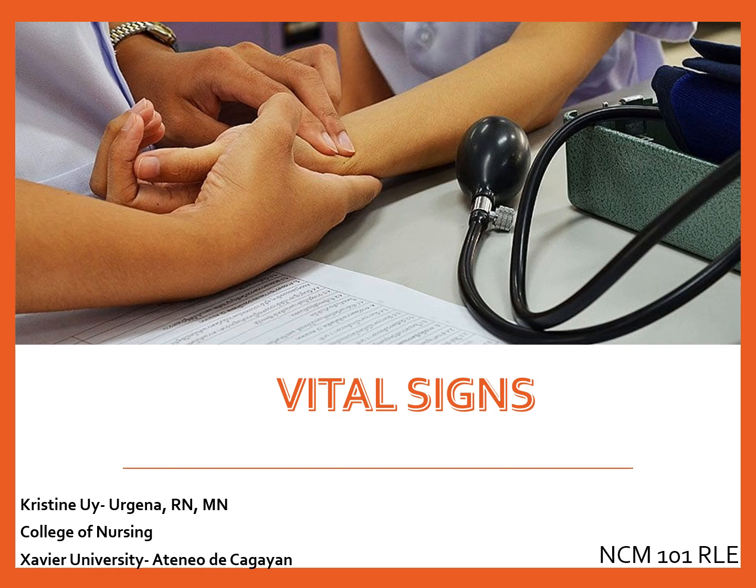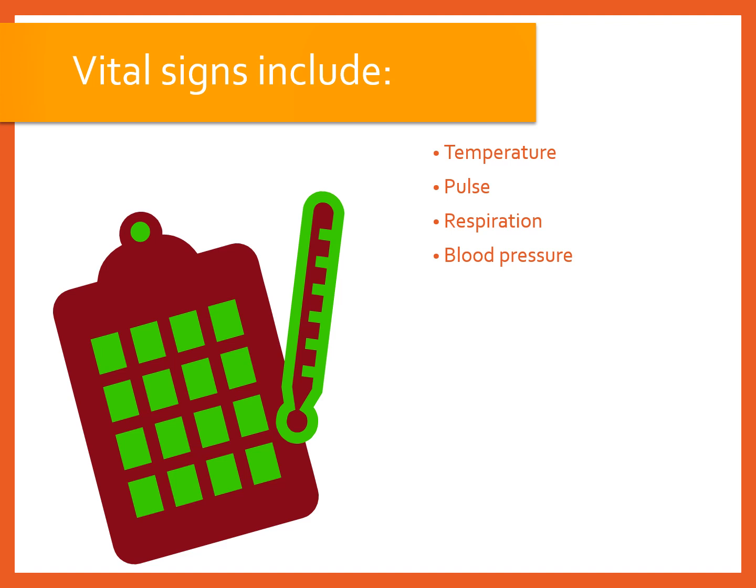It's a new year, and I'd like to welcome you back and bring you back to reality as we discuss another important lesson, which is the vital signs. So I need you all to buckle up, as vital signs and the taking of vital signs is a long topic, and for this topic you'll need to do a return demonstration which will be graded by your respective clinical instructors. Vital signs include temperature, pulse, respiration, and blood pressure.